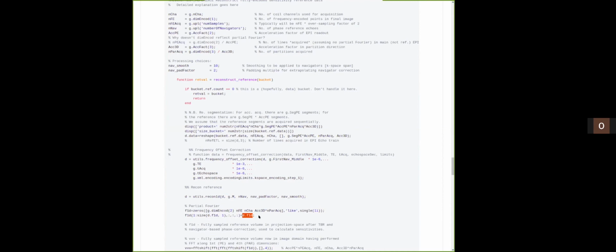So all of this is to enable me later on, when I'm sending images back to the client, to the scanner, or to Gadgetron, and then to the scanner, I need to have the data that are passed down the functional composition to actually include the header from right at the top, although functions intermediately don't actually touch it.